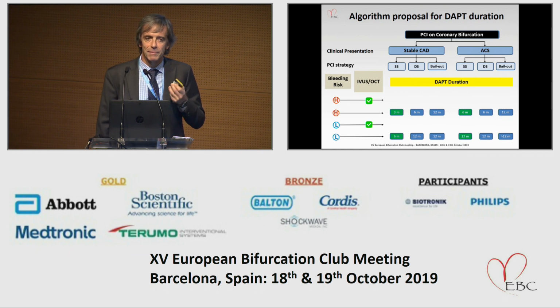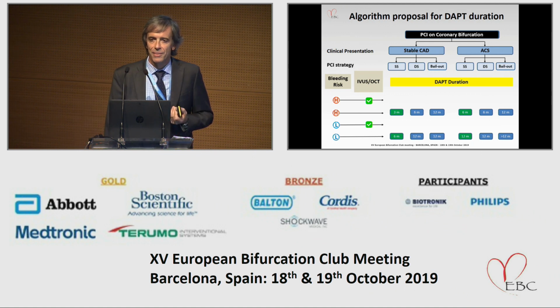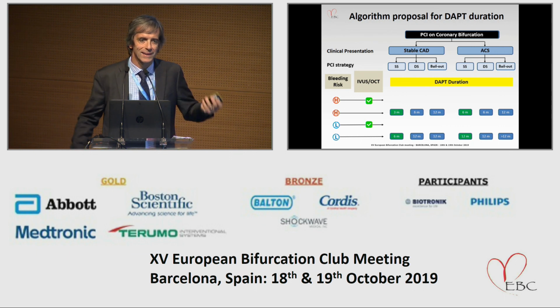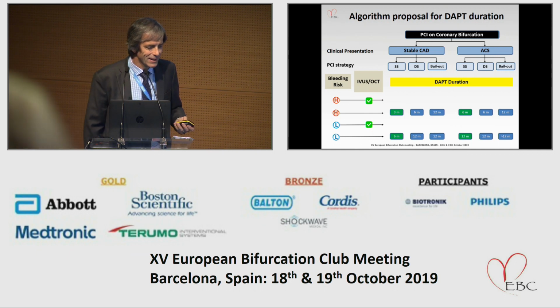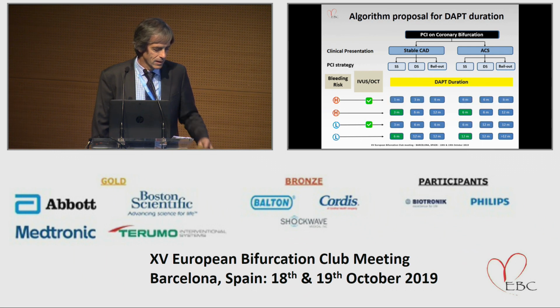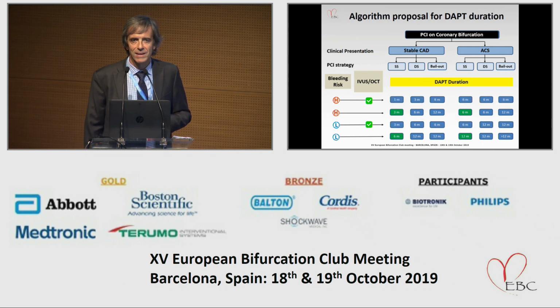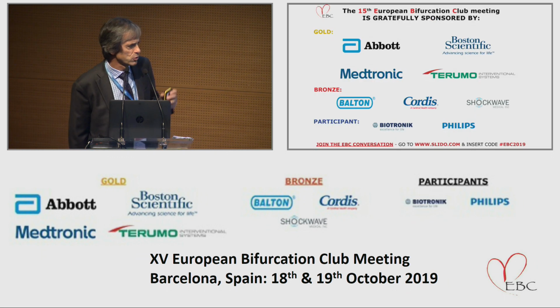When it's optimized, I do not go through whether my case was optimized or not, because there was a balance: from one side advanced age, from the other side the uncoverage of the proximal ostial circumflex, but it's real life. And so in these cases, we can decrease the intensity of the therapy, having a complex scheme, difficult to use, but perhaps useful to someone of you, and I am now open to discussion. Thank you. I was on time.